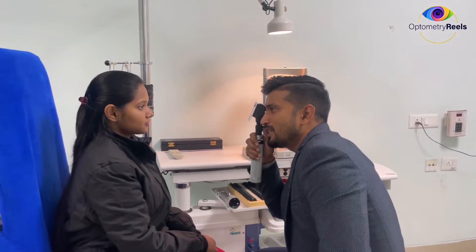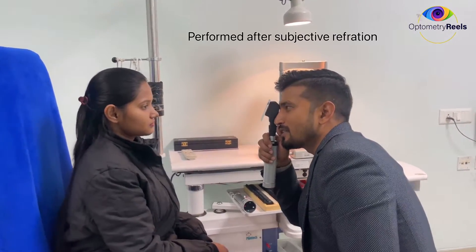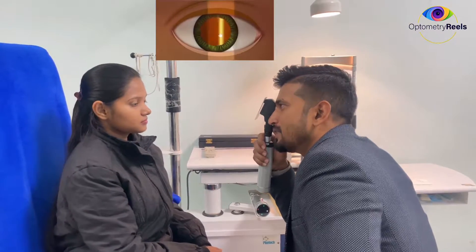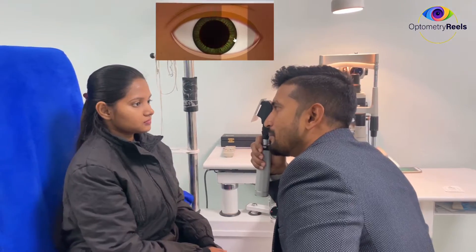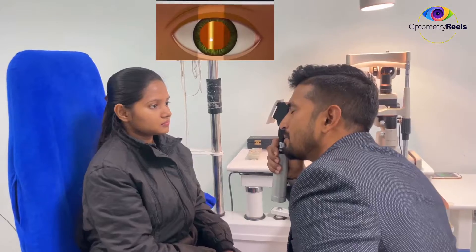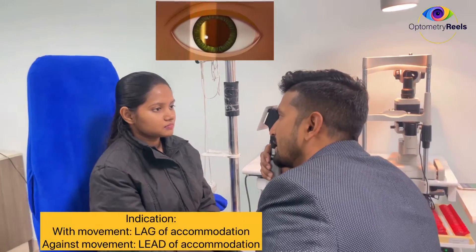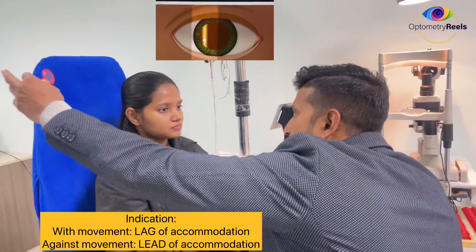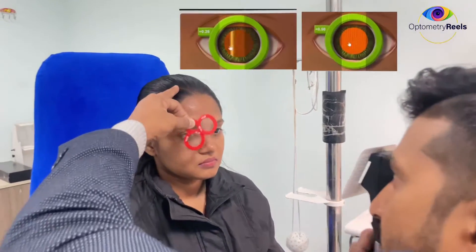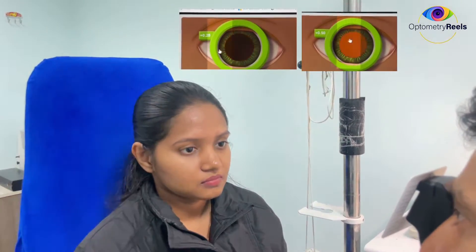The patient has to be fully corrected for refractive error. Our patient is emmetropic. What I can see is with movement, so I will be neutralizing that in one meridian. We usually perform MEM in the horizontal meridian by placing the streak vertically. So I am seeing with movement, and I will quickly place the lens in front of the eye to neutralize it.